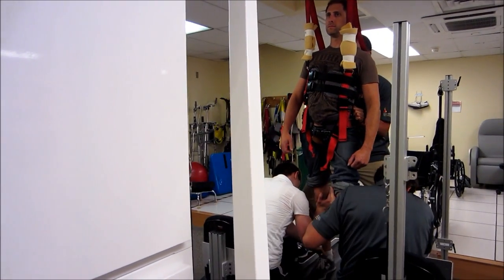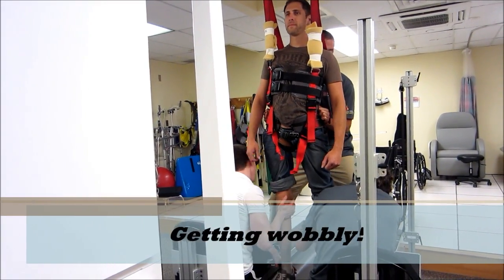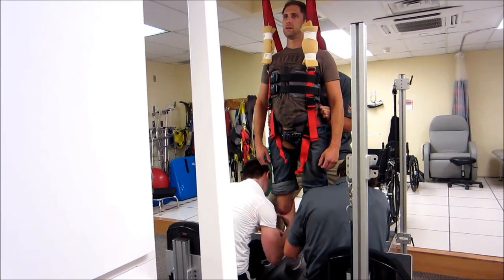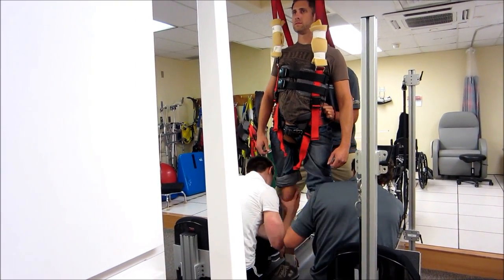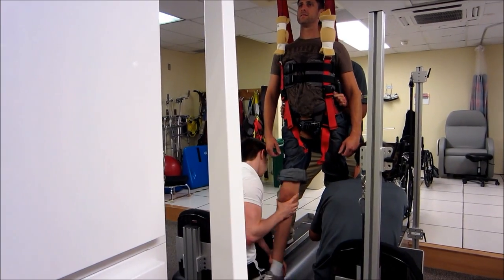It's fine, Jann. It's starting to sweat a lot, right? Yeah. Bring me up a little more.